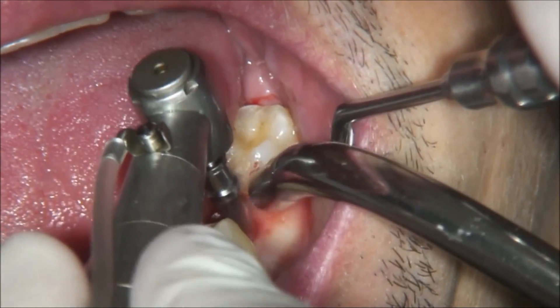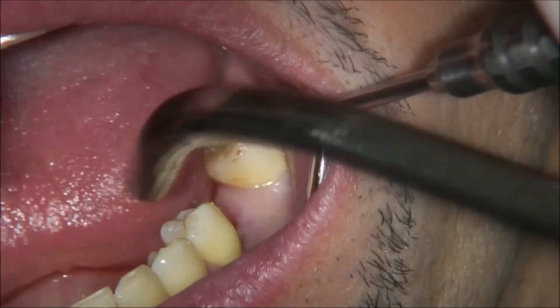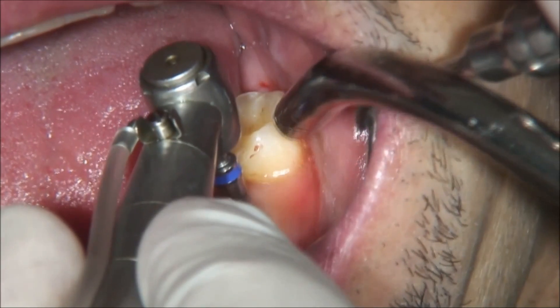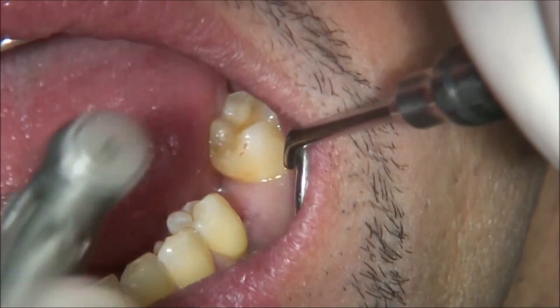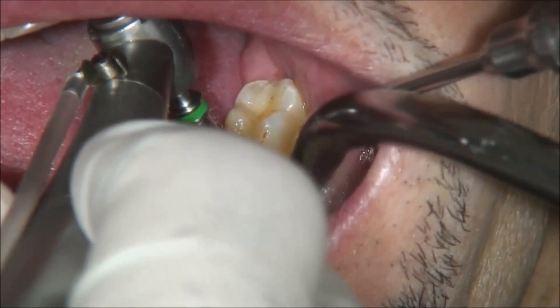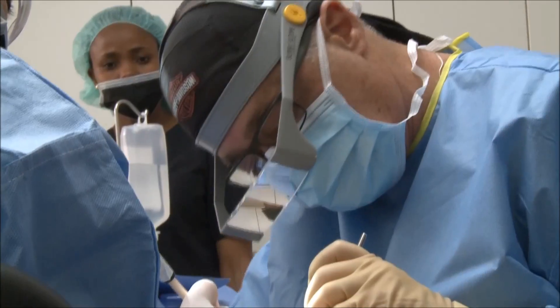This is just to show you how easy it is to use the telescopic drill. For the 4.2 mm implant, we need to use the 3.2 and the 3.65 mm drills in order to create the final cavity for the 4.2 mm implant. Now we finalize the cavity.